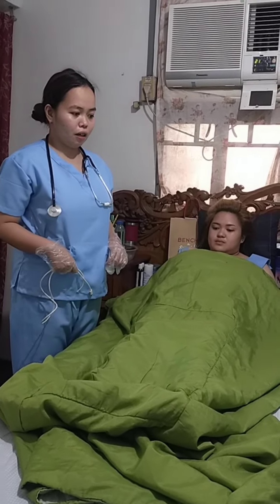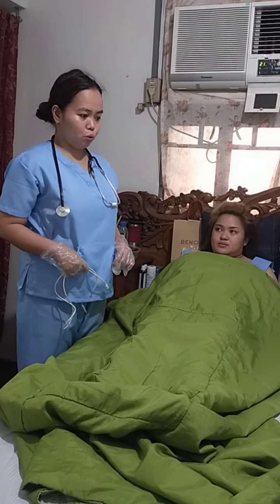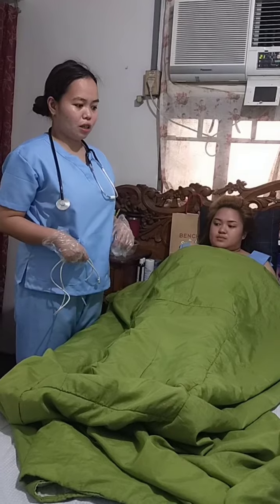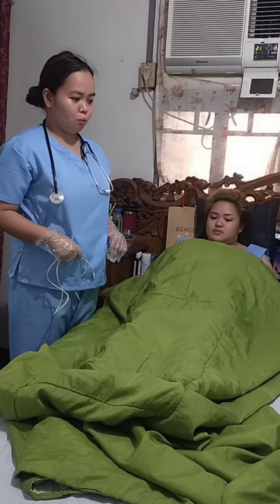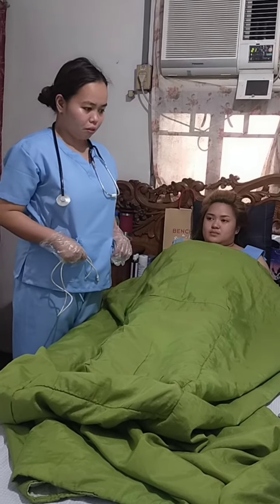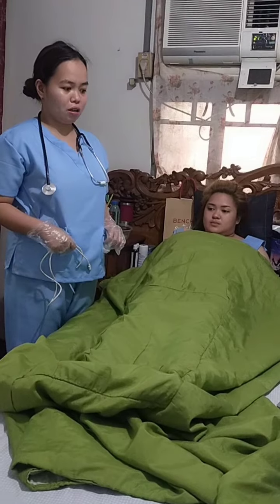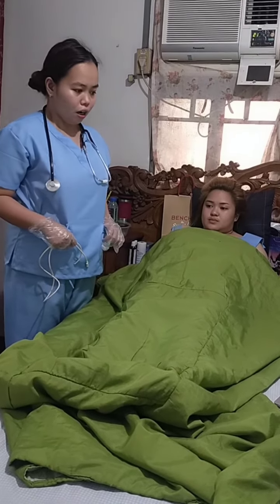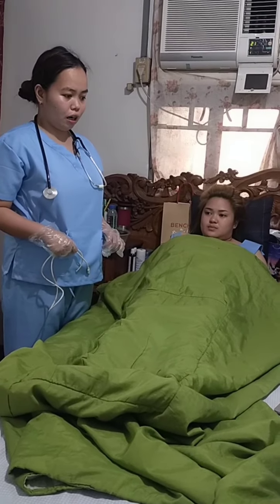If gagging and coughing persist, check the placement of the tube with a tongue depressor and flashlight if necessary. Keep advancing the tube until the marking reaches the point, following the normal contour of the nasal passage while inserting the tube. This reduces irritation of the mucosa.